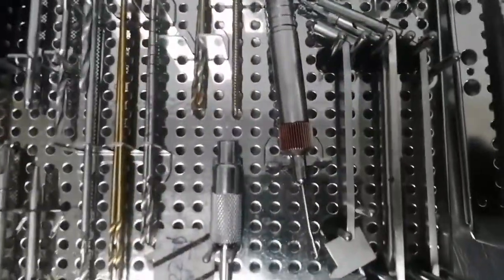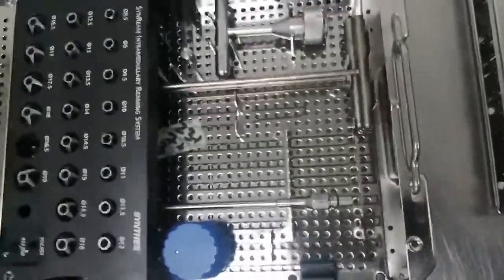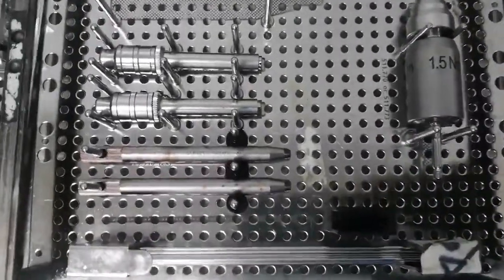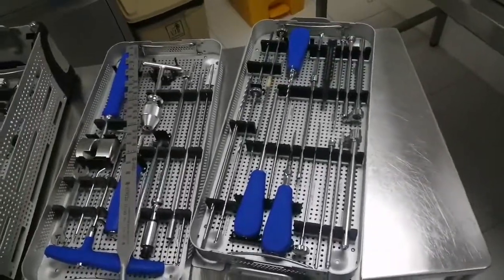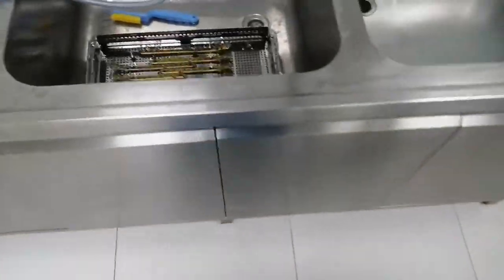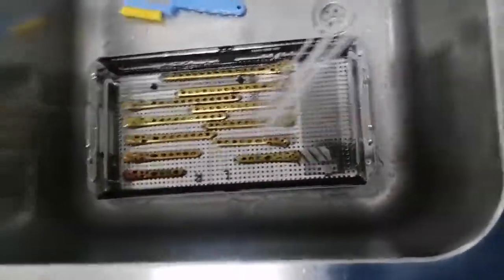I will teach you how to perform the proper way of cleaning step by step from this company set. As you can see, there's blood over there — this is used — and some of them are not used. But still, even if the instruments are not used, we need to follow the proper procedure of cleaning.